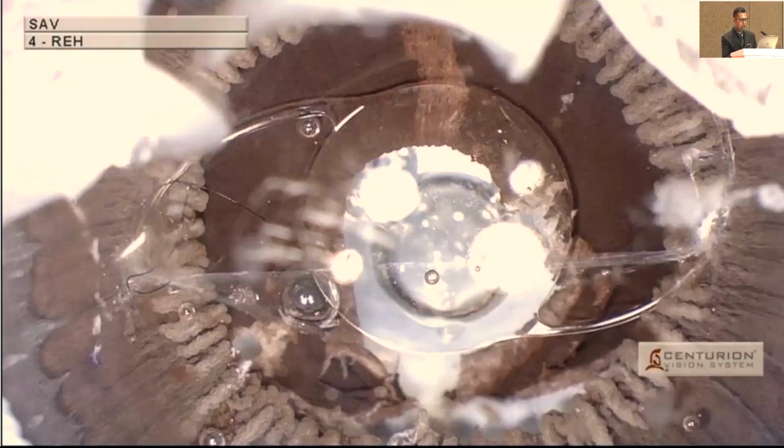Now this is how the IOL would look if you were to see it from inside the eye. Those are the fixation points, but notice how the haptics go beyond the fixation and rub through the ciliary processes all the way. This is a larger IOL, and it's very anteriorly placed. As you can see, it's almost touching the iris tissue.